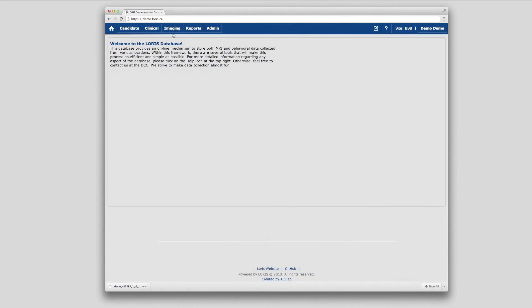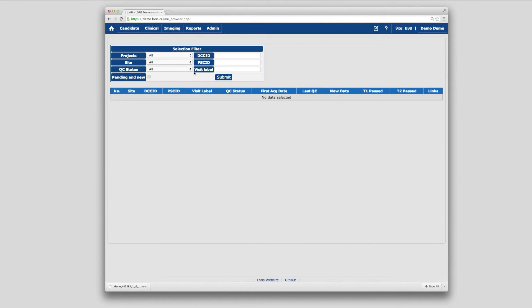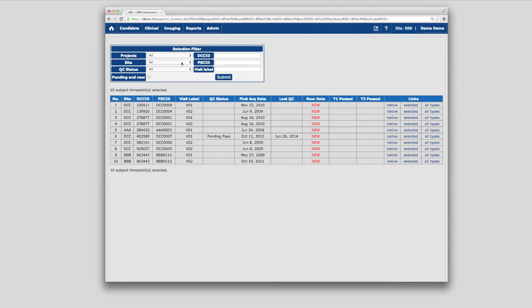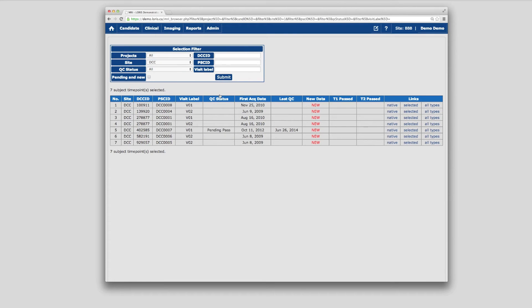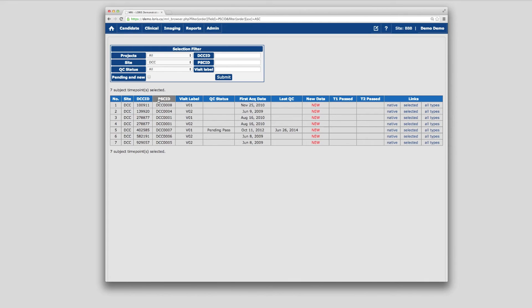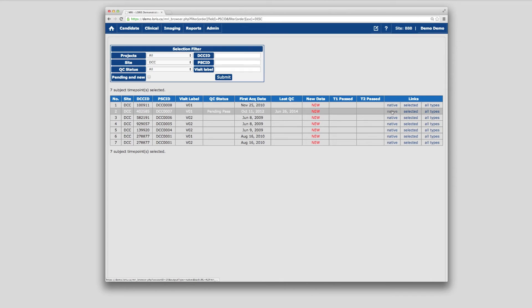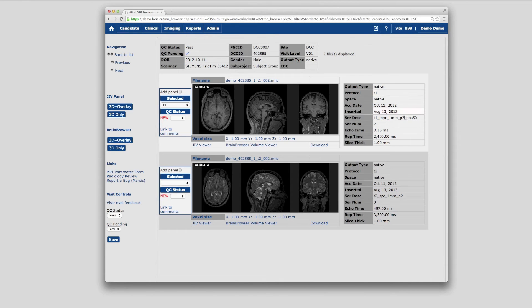From the imaging browser's front page, click Submit to view a list of all imaging data sets stored in LORUS. The list can be filtered and sorted by metadata fields such as site, candidate ID, or quality control status. Clicking on any cell under the Links column — for example Native — will bring you to the Scan Acquisition page, which displays the selected imaging data in detail, scan by scan.